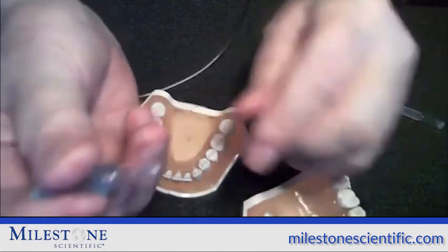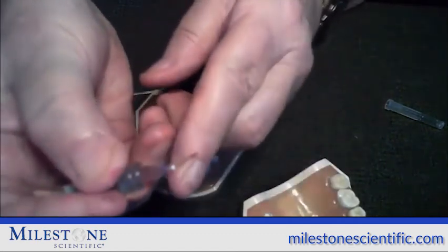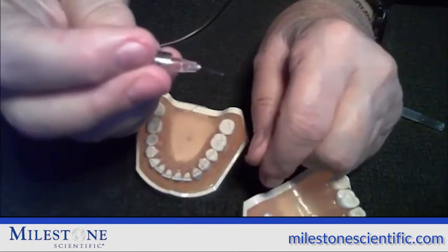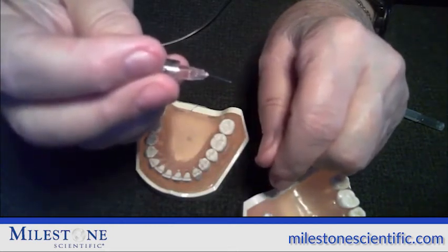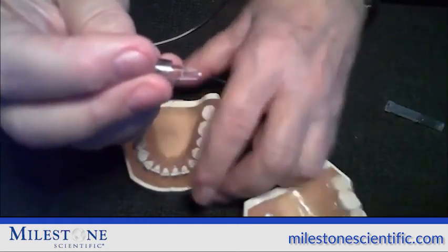The next thing I do is find the bevel of the needle, that flat spot, and bend the needle just slightly, maybe 5 degrees towards the bevel. So you can see that there's approximately 5-10 degrees of a bend towards the bevel, which allows us to see where the bevel is in the mouth when we're doing the second stage of the injection.